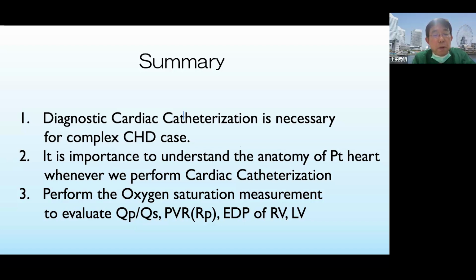I do not mind if we divide it in two. Of course, we can also do it simultaneously. We do the diagnostic catheterization first and then move on to the interventional case. That should be okay, but I think it depends on each circumstance.